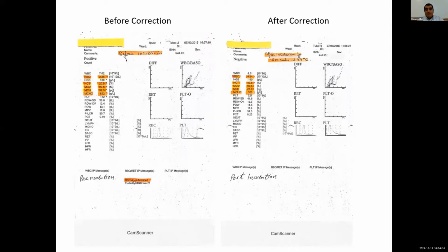This patient sample was incubated for 15 minutes at 37 degrees centigrade, and when we checked the result by retesting of the sample, the MCHC dramatically fell to 320 gram per liter. So we achieve complete correction of this situation, and here we can notice that RBCs is increased and the hematocrit is increased, MCV a little bit corrected, and the MCHC also decreased to the correct values.